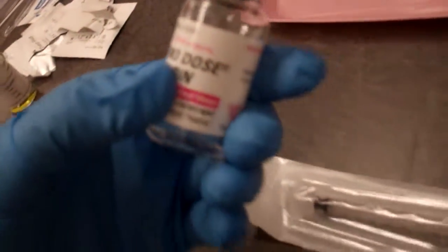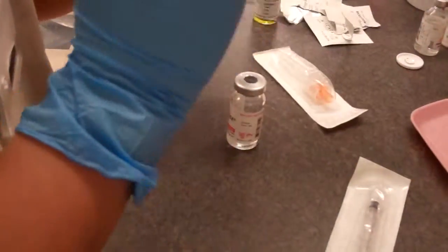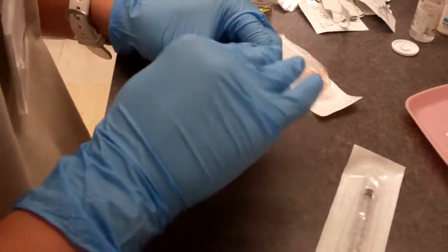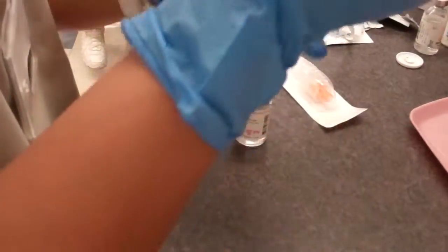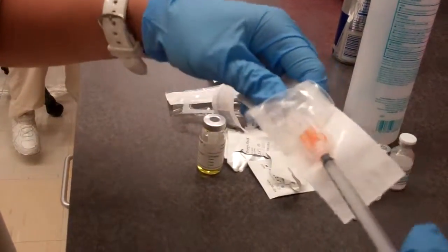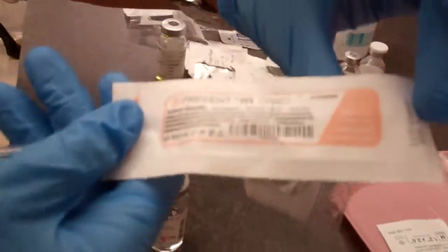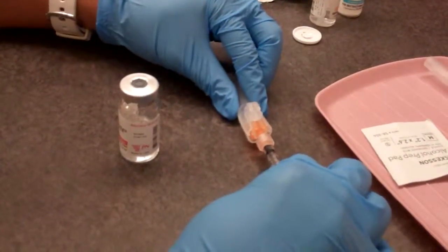And then lastly, I have my heparin. It's 10,000 units per 1 ml. And I need 5,000, so I'll be giving half. Wipe the bottle. 1 to 30. Turn my needle. Make sure it is secured. And since it is sub-Q, I'm using the 5/8 25 gauge. Let's draw the needle. And I need half.